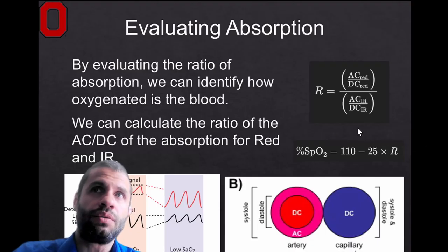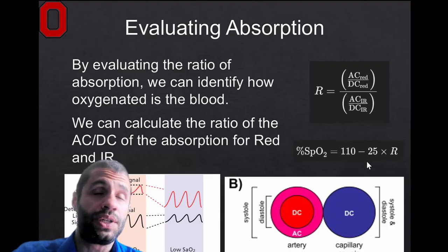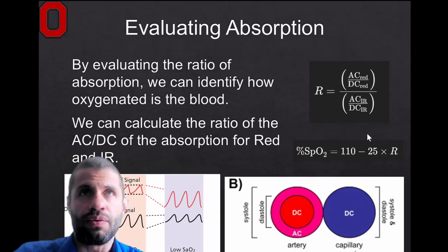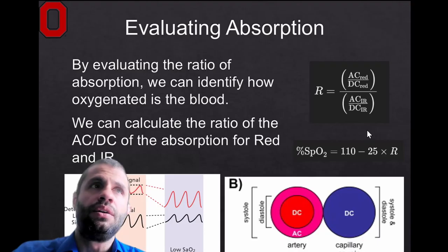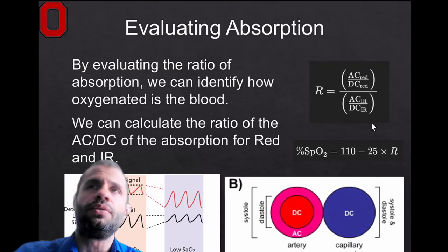If you do some research online, this is the more standardized equation. It is not to mean that it is universal and that these numbers are written in stone. But these are the ones that are most standard, and these are the ones that we're going to use. But I think it's important to note that a lot of this experimentation and device development relies on validation and testing from a medical device type of procedure.